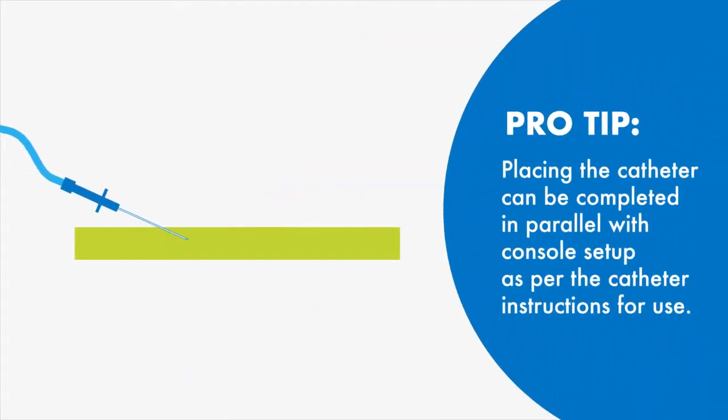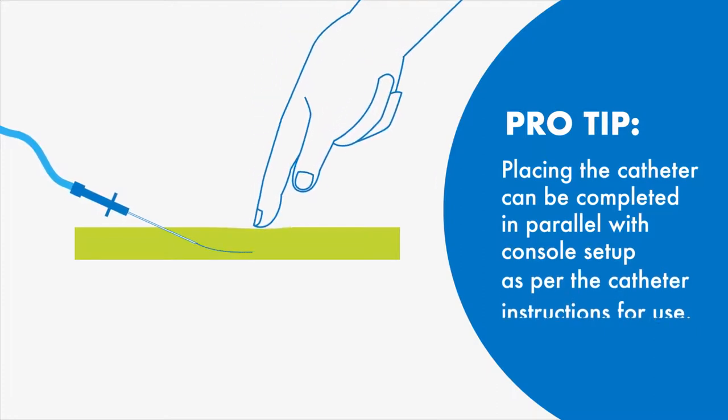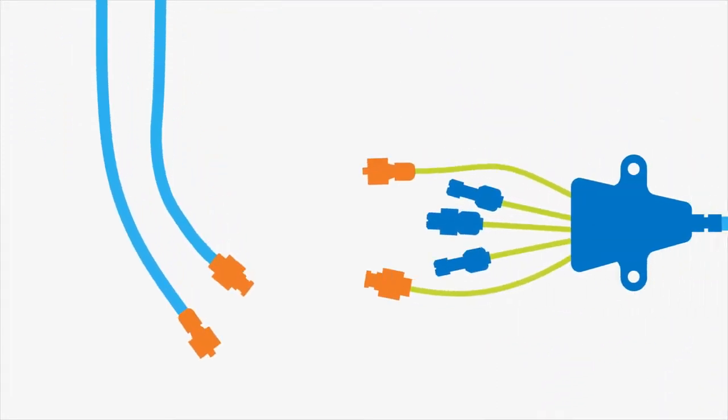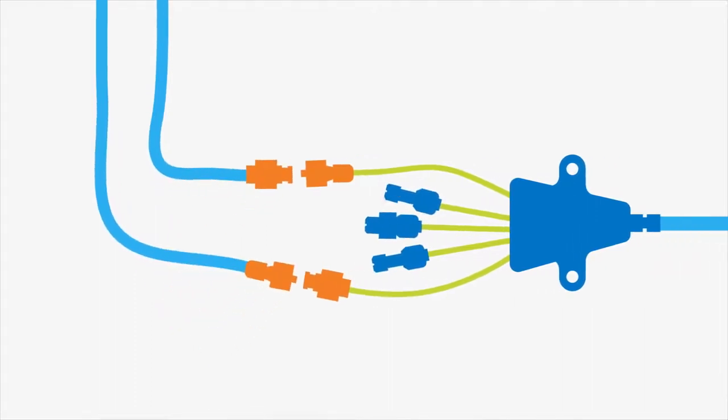Place the catheter using the standard Seldinger technique. Now connect the startup kit tubing to the catheter.